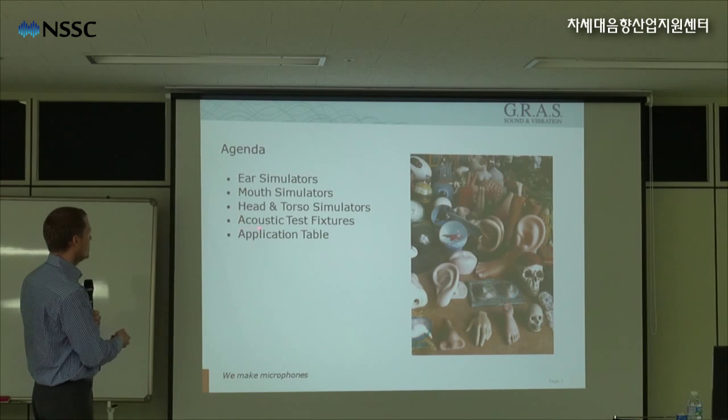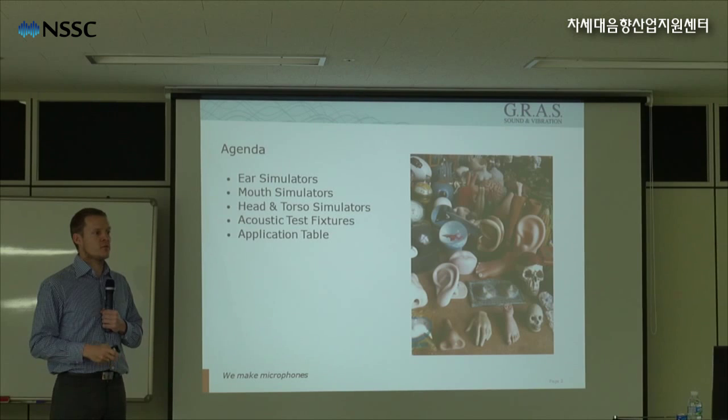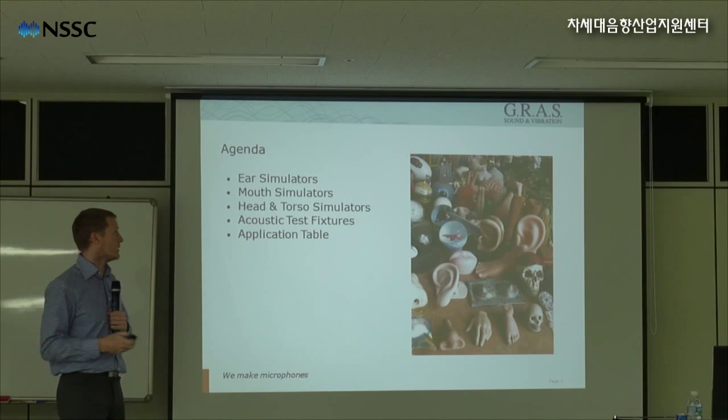Then we have different acoustic test fixtures. These can be test fixtures for telephone testing or different kinds of fixtures that test the acoustic performance of different electronic equipment.